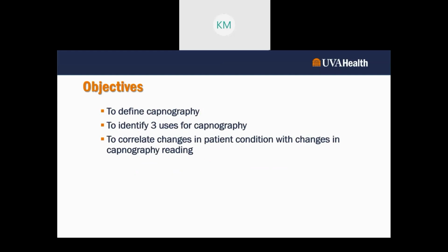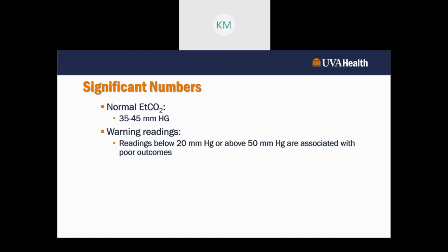Our objectives throughout the entire series are to define capnography, which we did in our last lecture, to identify our three uses for capnography, and to correlate changes in patient condition with changes in our capnography readings. So we're going to hit those last two here today.